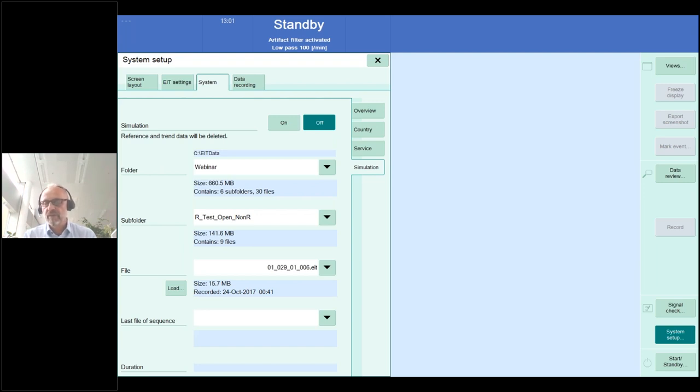However, we also see in the regional ventilation delay that if this takes place in larger regions in the ventral part, this can also be an indicator of emphysema, for example, where we typically see regions with extremely long time constants. And also in spontaneously breathing patients with a high respiratory drive, we can identify patterns of Pendelluft. That is another very interesting part. The time today didn't allow me to present these patterns, but as a conclusion, the use is more the recognition of different patterns suggesting different lung pathologies, because in the healthy lung we typically do not see these effects of regional ventilation delay so much.